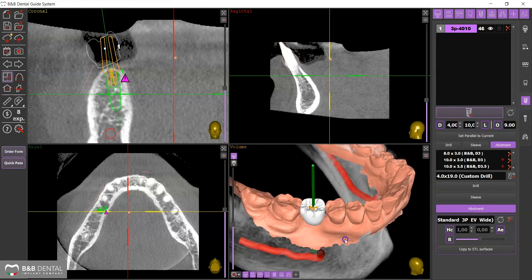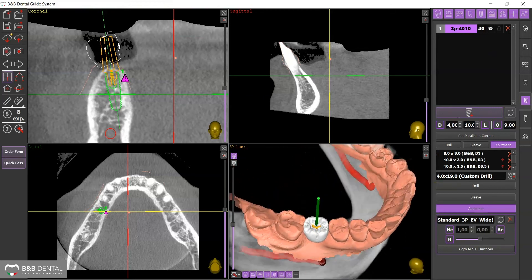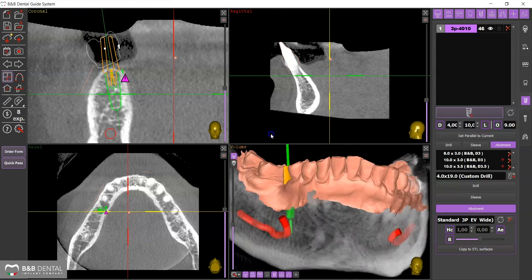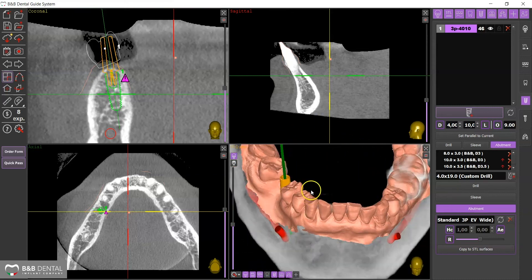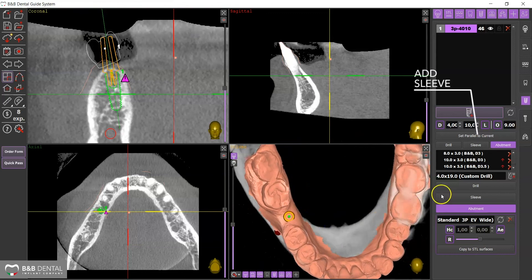By clicking on the object, you can now move and rotate the implant into a favorable prosthetic position. Click on Add Sleeve to view the sleeve.